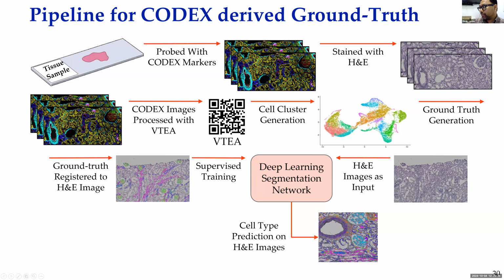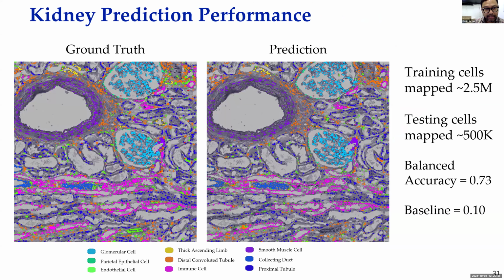Once we have a ground truth, the same histology image and ground truth cell types, we train the model to find out where the cells are. And this is where we are today. We have 14 sections. In 3-4 years, I was able to generate only 14 sections, which are really, really good with respect to their corresponding level. But we have mapped 2.5 million cells while doing the work, which are precisely mapped ground truth, and which took us real effort in the last 4 years.